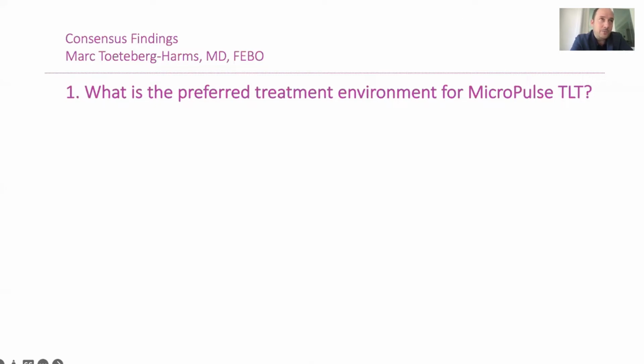When we reviewed the literature and calculated fluence and total energy for the different studies where we had the information, we saw that there was a better relationship between fluence and pressure reduction compared to total energy. And that's the long story, sorry, Rob, about how we came up with this.